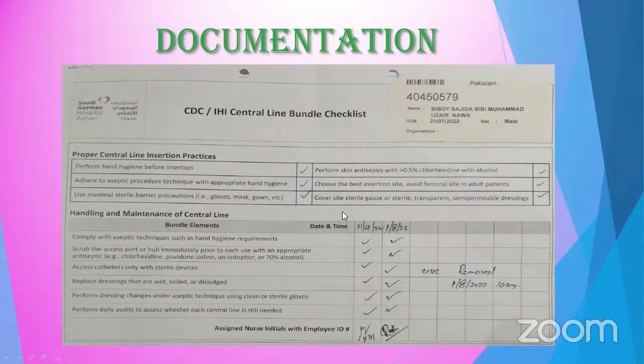Then every day, we should check. This is only 2 days because the UVC was already removed on August 1 at 10 a.m. So comply with the aseptic technique, yes. Scrub the access: if we are giving medication, we always wipe first with an alcohol swab prior to giving medication. Then access the catheter only with sterile devices.